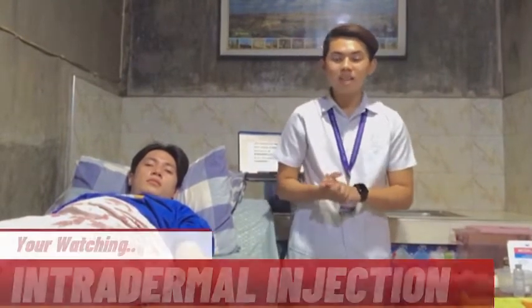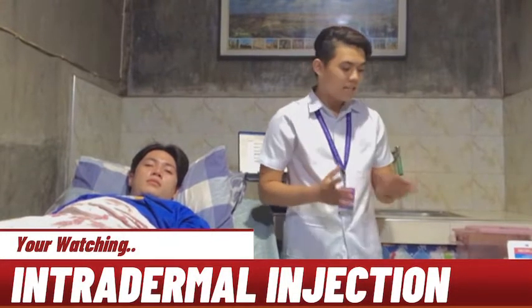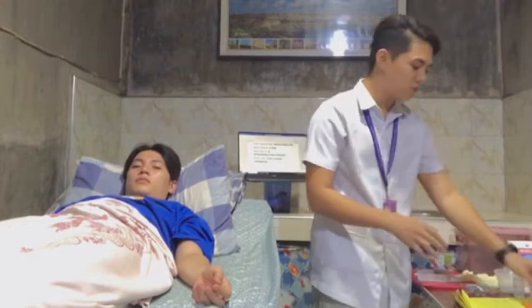So after that one, let's start with intradermal injection. This will be the introduction of a solution by means of a syringe and the needle into the superficial layer of the skin. Of course, first we will be checking the doctor's order on the patient's chart because the chart of the patient is more reliable than the medication tickets.